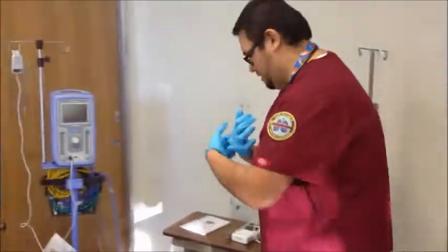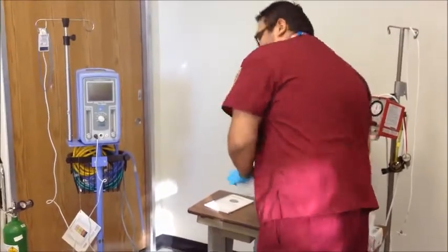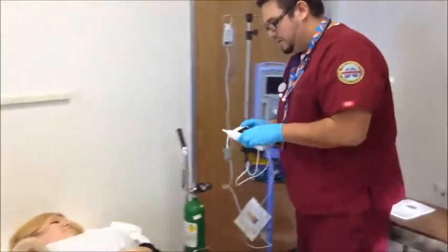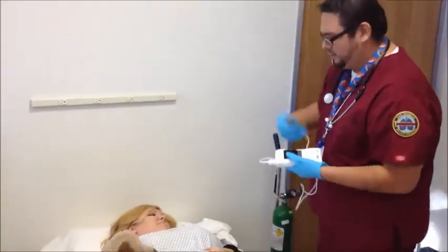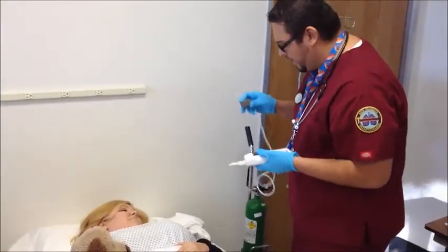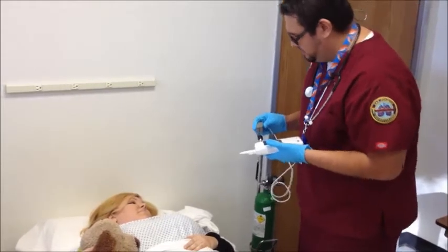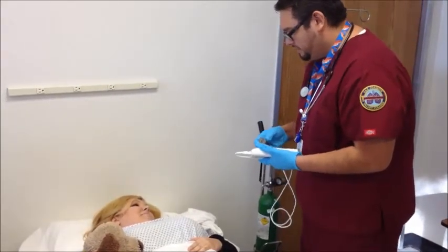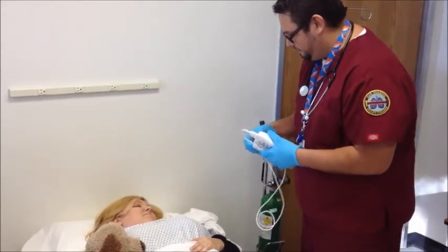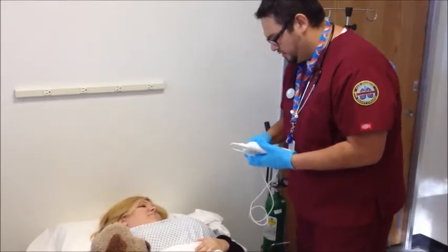I'm going to go ahead and get this right here. Do you know what this is? No. This is called a pulse oximeter. I know it sounds kind of futuristic — Star Trek-y — but it's actually just a machine that's going to measure to see how much oxygen is being applied. I'm going to go ahead and put this on you so I can check to see how much oxygen you have running through you.